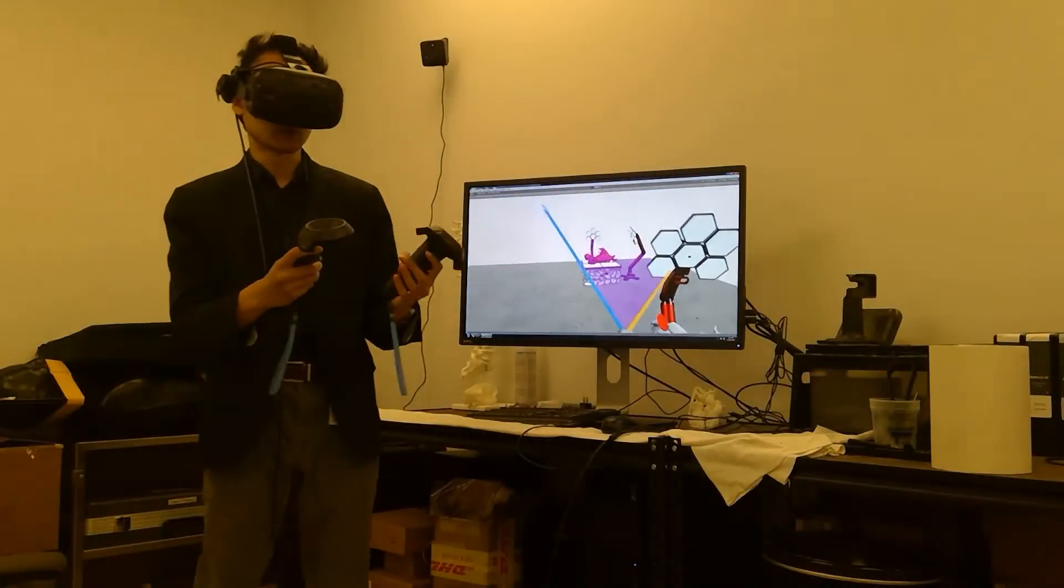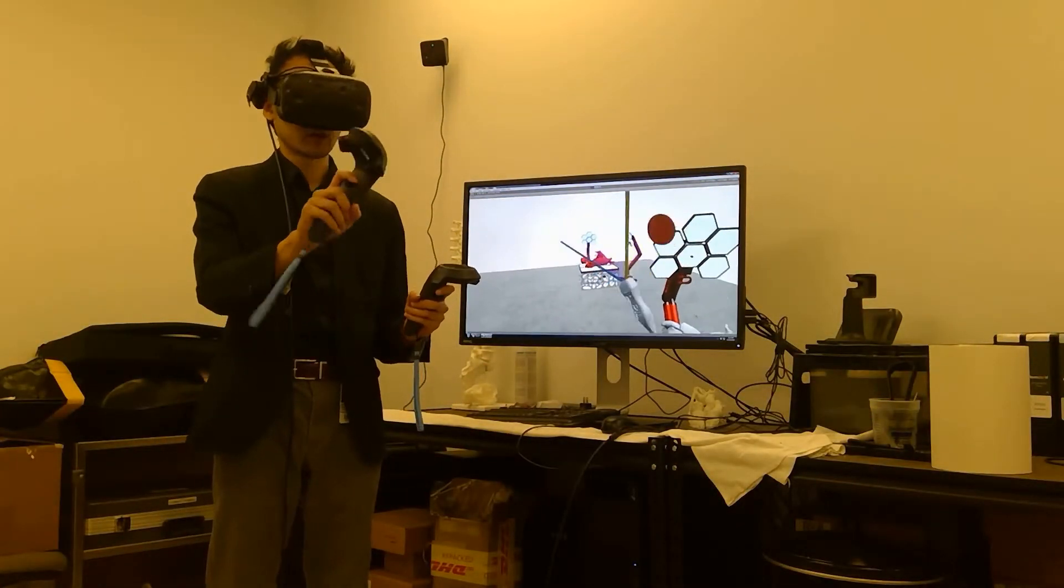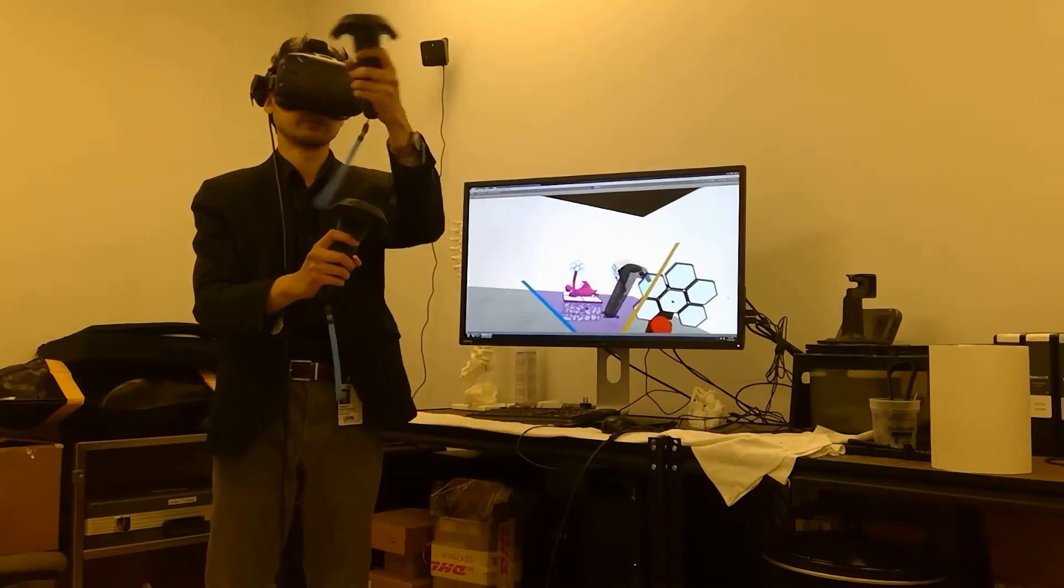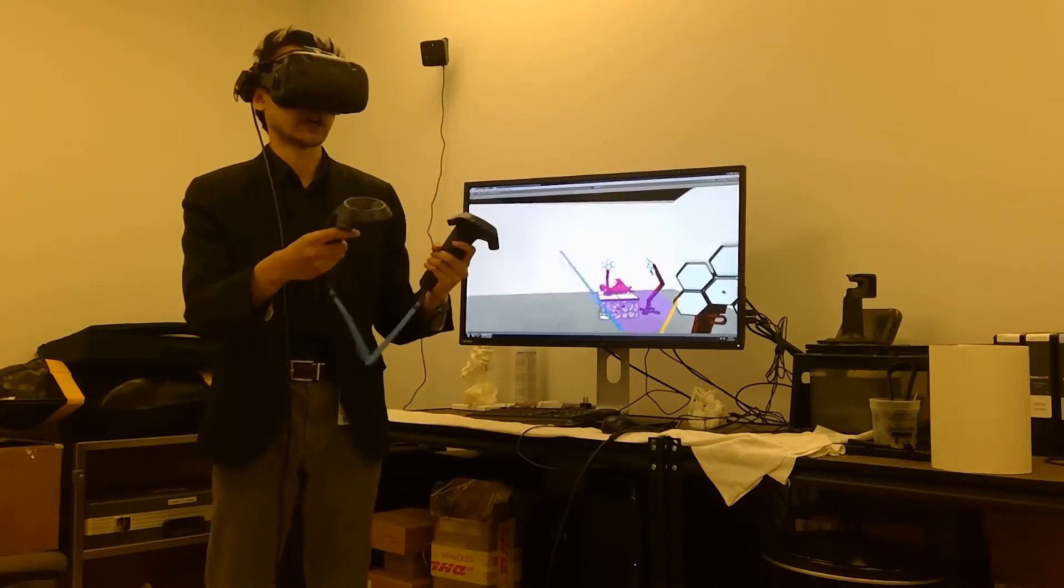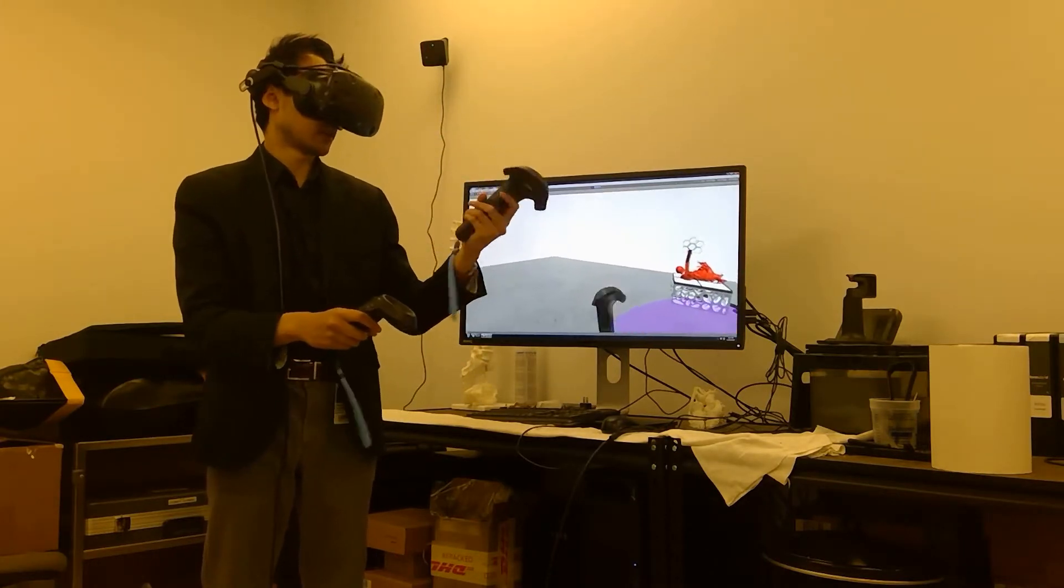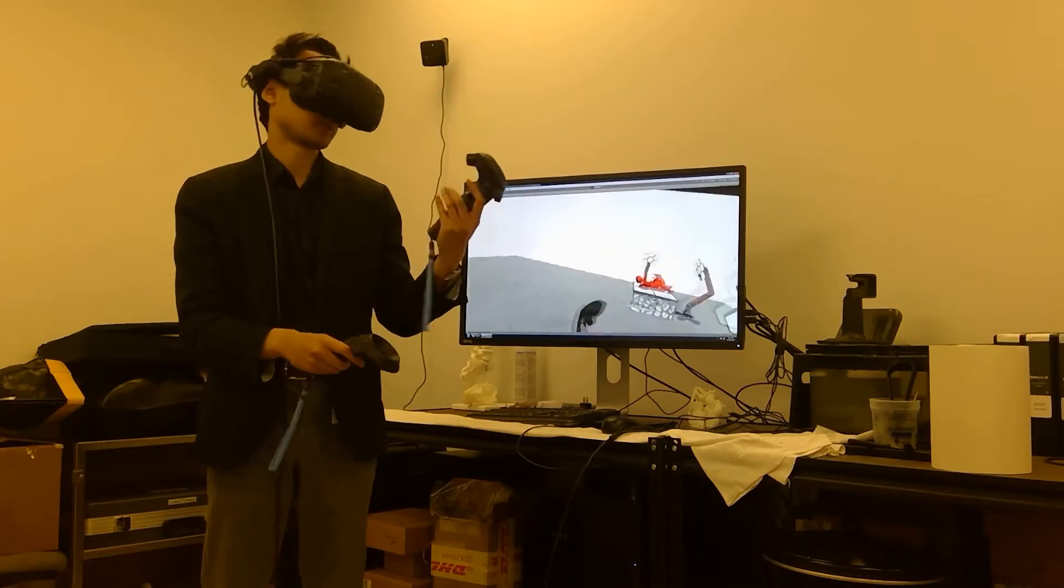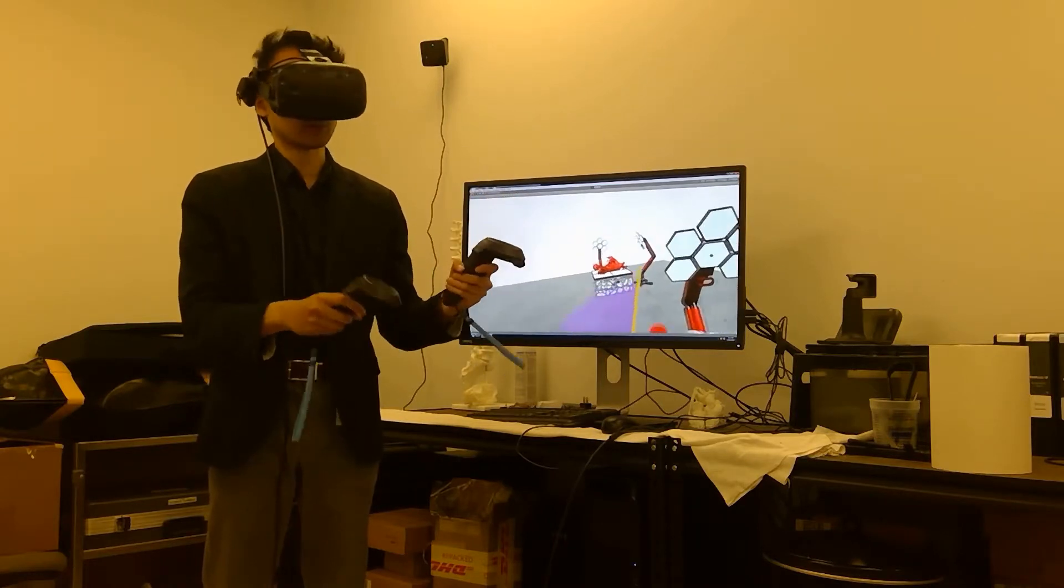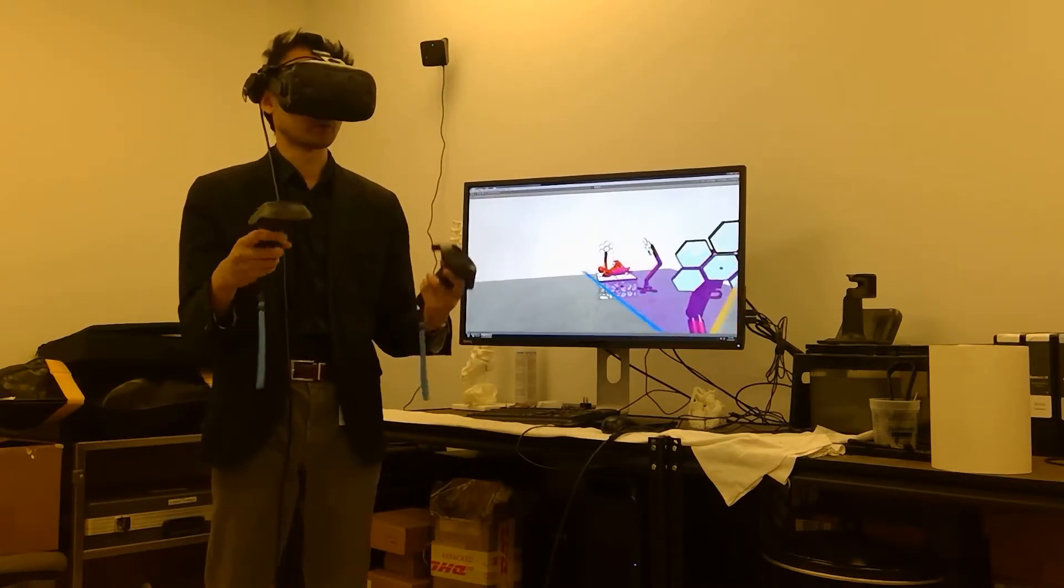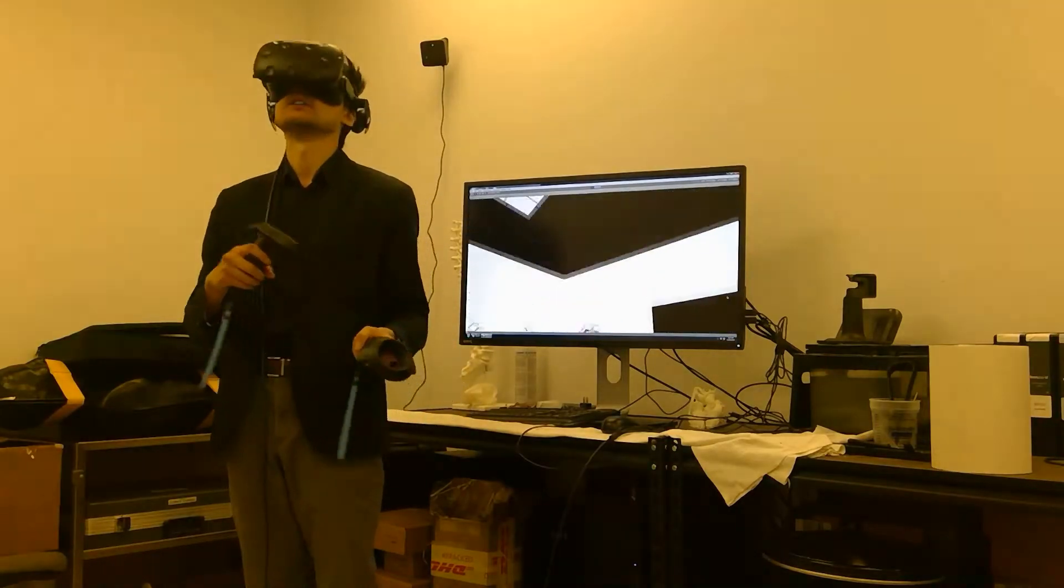First things first, here are our controllers. In my right hand is the mock transthoracic probe with the ultrasound beam plane, just a guide for whoever's using this. And then in my other hand is just the standard controller that allows us to manipulate objects and teleport around the room should we want to.